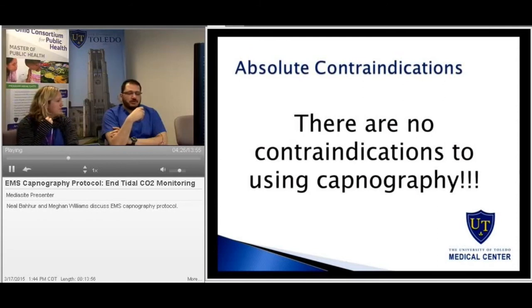There are no contraindications. That's right. There are no contraindications to using capnography. So when you can, use capnography. It can definitely be your friend in these pre-hospital situations. Again, no contraindications.